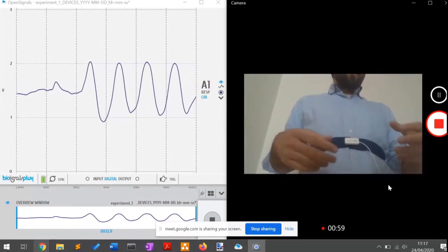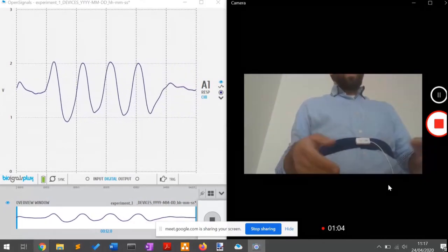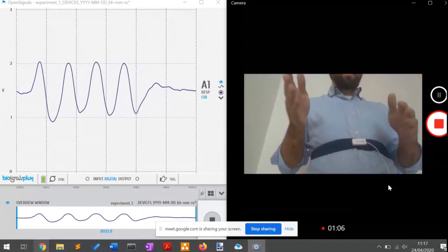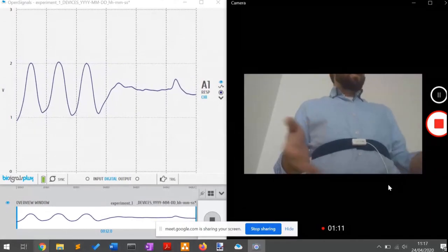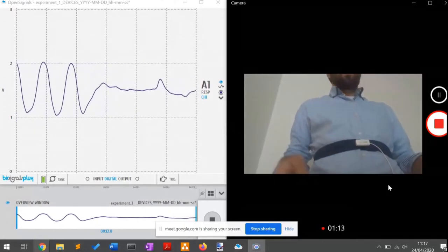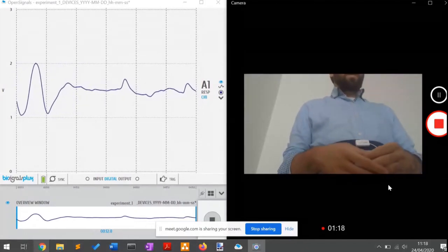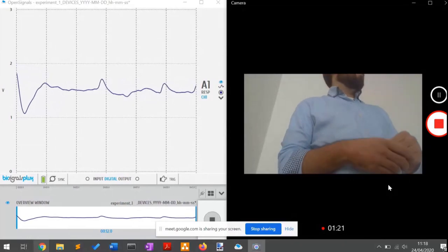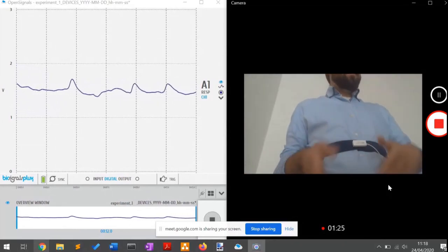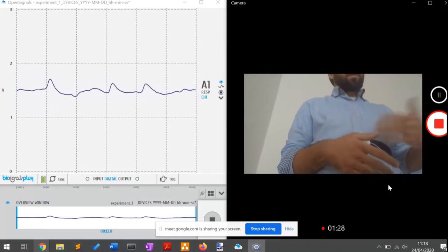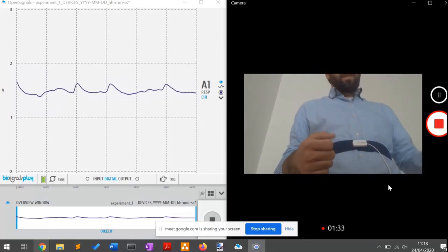We see it very clearly. This is a very typical respiration signal — we have a sinusoidal waveform. If we take the peaks of the signal, we can extract information about the interval between peaks, and from this we can also extract the respiration rate, which might be very interesting to detect whether somebody is calm. For example, if you are calm, you might have a lower respiration rate rather than when you are under stress or nervous.